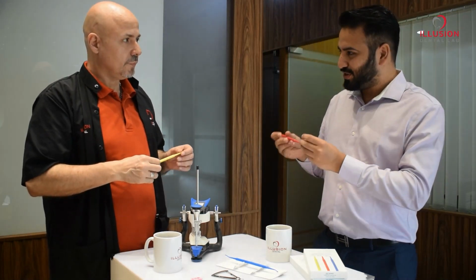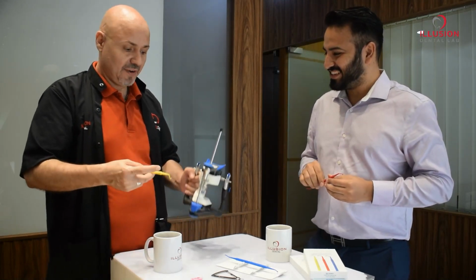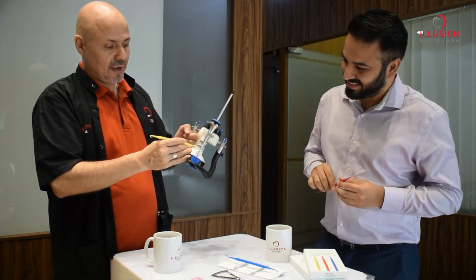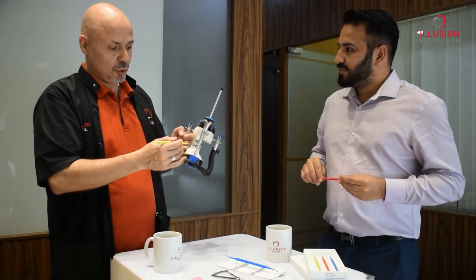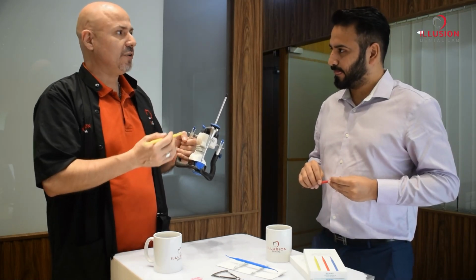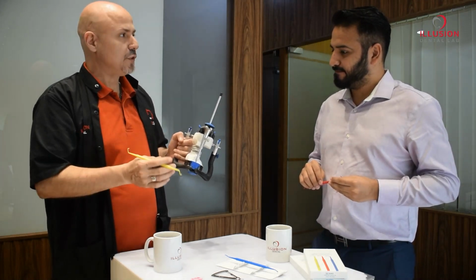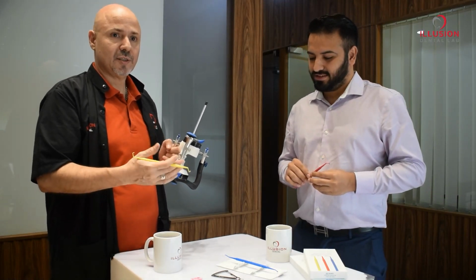I mean, we could even check right away, right? Yes, and we did exactly this. So we are in a very good position to have good communication with the customer, show them pictures, try in, and make sure the case has sufficient clearance before it really goes into process, so that we don't face exactly these problems at a later stage.